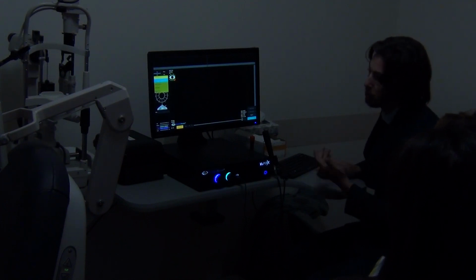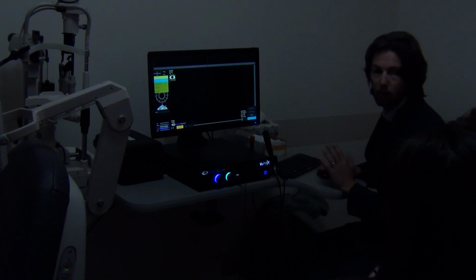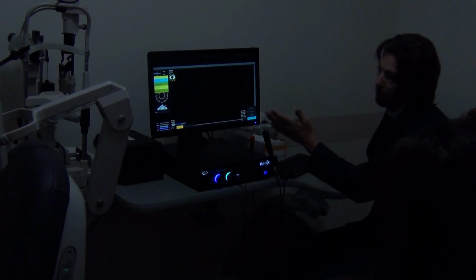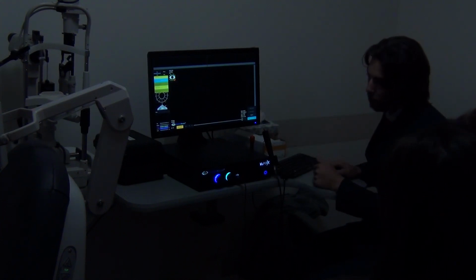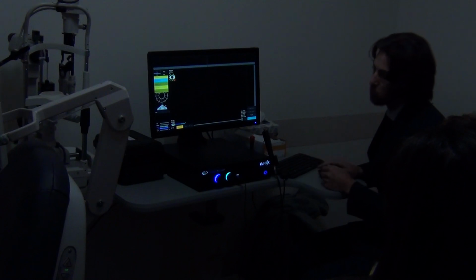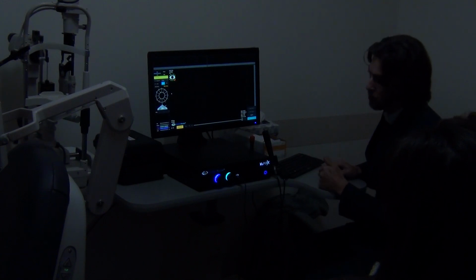So, high resolution, same thing. It's totally up to you to choose. I see some people doing just high resolution on all, and they're fine with it. The more you perform tests, you may find other features probably more appropriate for you, or if it helps you to see better picture, use them. So high resolution is fine, sulcus to sulcus. Let's do that because we're gonna do the sulcus to sulcus measurement.